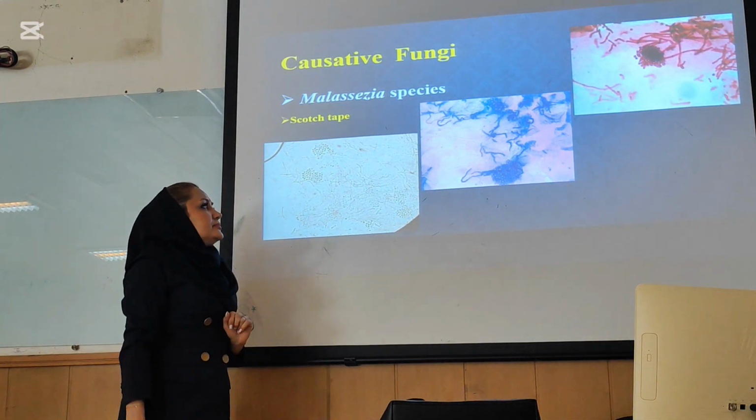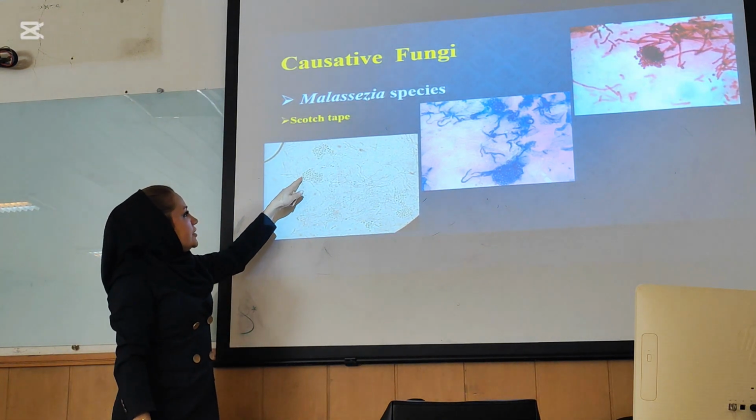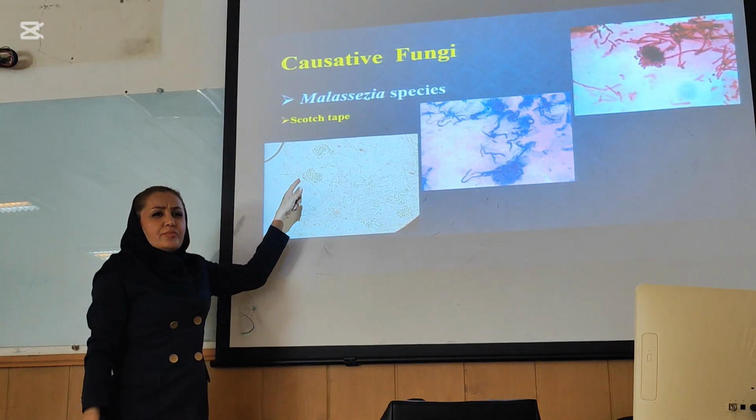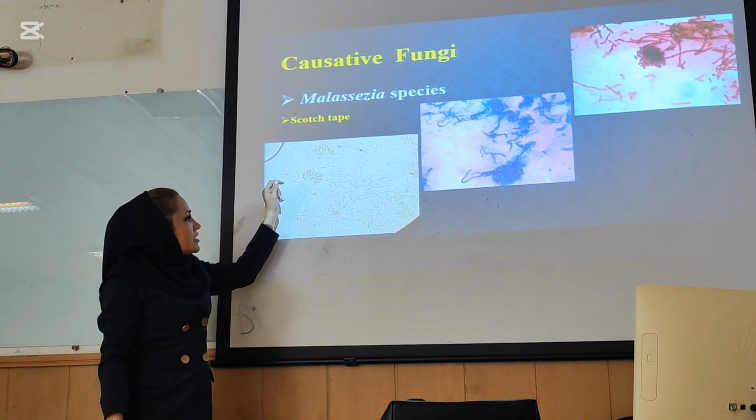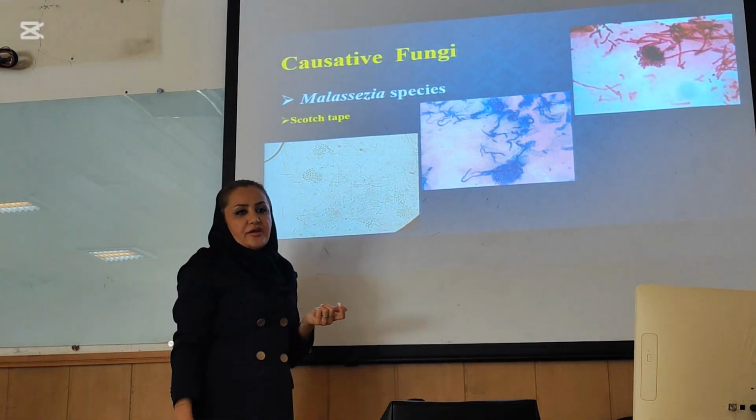In this infection, in direct examination, we have grape-like clusters of blastoconidia and curved or thick fragmented hypha.